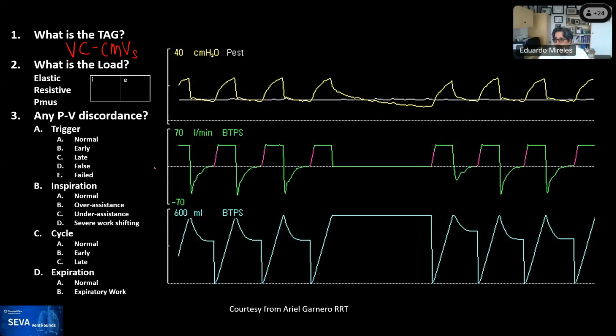Good comments, right? So the presence of a leak during inspiration means the pressure required to inflate the system, or that you're going to see, is going to look less because there's higher compliance. So that may affect the total pressure if the leak is present during inspiration. And then during expiration, now you would have lower volumes, but you're not seeing that higher compliance.